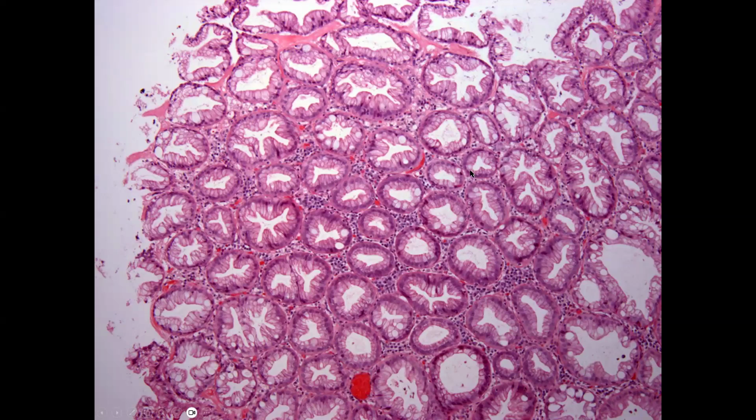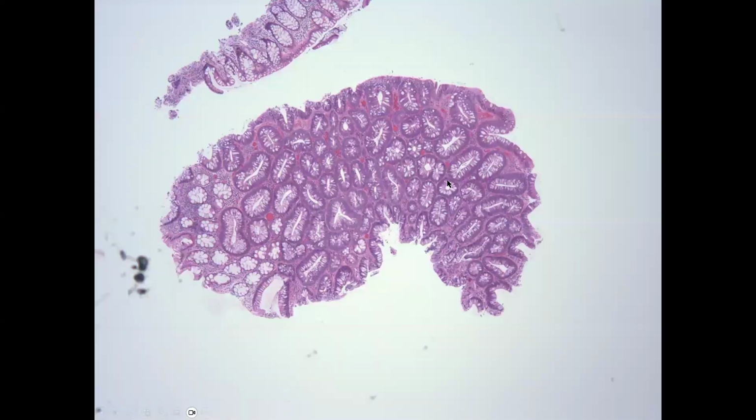Moving on to a different entity in the stomach here. Actually, let me skip over this one. Sorry, that was the colon. I misspoke, but this is an entity I want to point out here.